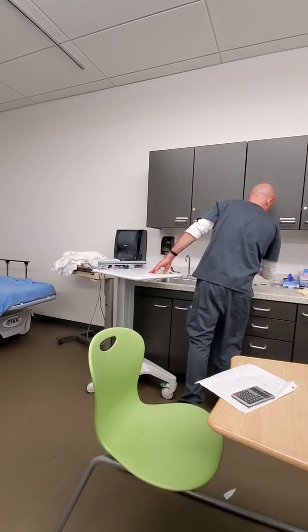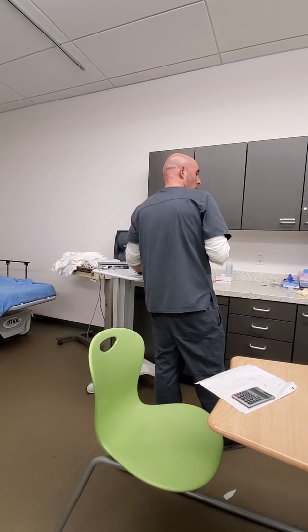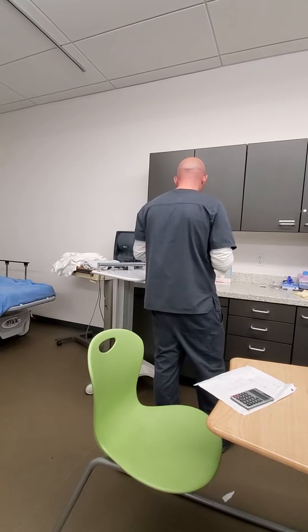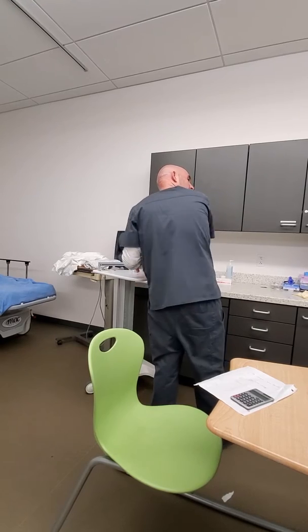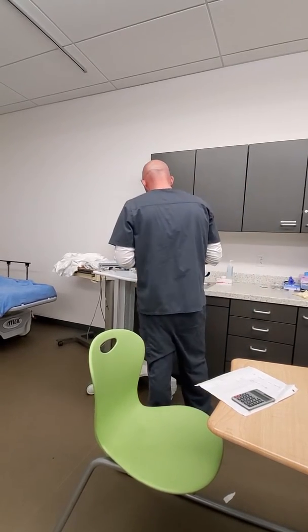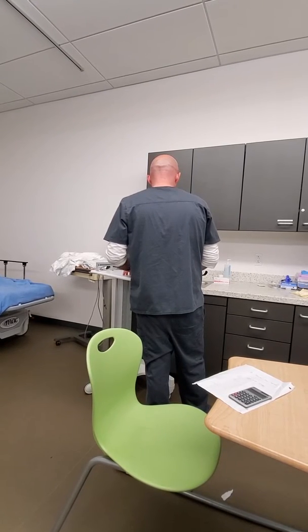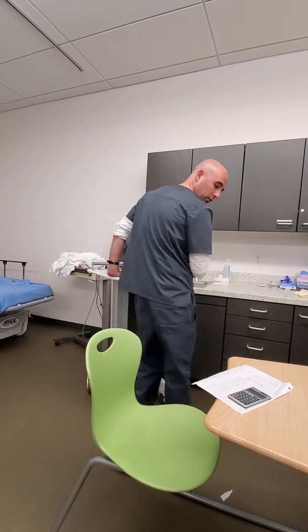Okay. But if you bring it in and put it down in the patient's room, you can't bring it back out. So keep the extra in your pocket. Yeah, and I can't open that packaging, it has to stay in the packaging. Then I'll have my cap, and then I'll have my 2 alcohol pads, and then I'm going to need a labeler. I'm going to be labeling this.